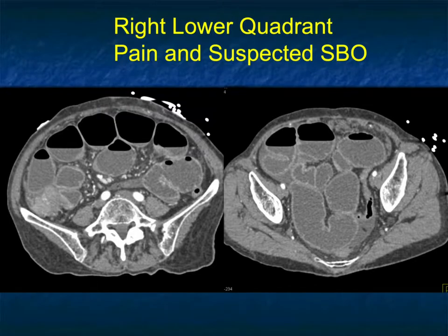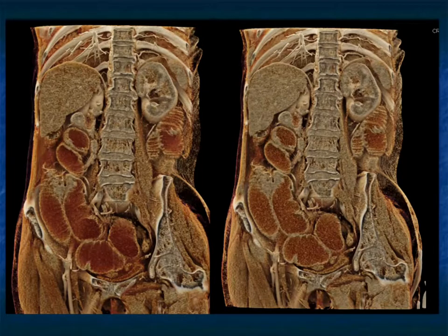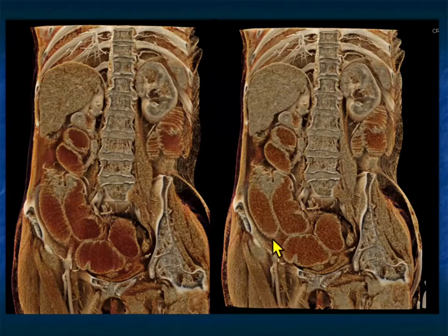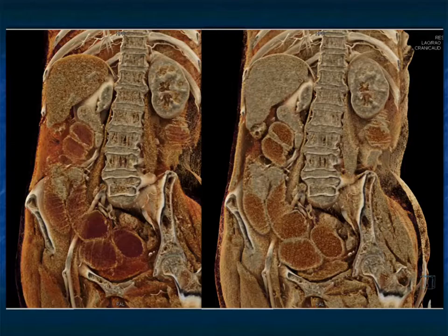Another patient — with right lower quadrant pain and suspected bowel obstruction. You can see the patient's small bowel is dilated and there's some soft tissue in the right lower quadrant. Is that in the terminal ileum, ileocecal valve, or cecal level? There it is very nicely on the cinematic rendered views, showing the dilated fluid-filled loops of bowel and the mass — possibly a tumor at the very distal ileum or ileocecal valve level. The surgeon knows precisely what needs to be done. Transition points for small bowel obstruction are often hard to determine, but looking at things in a volume makes it easier, and cinematic rendering makes it better.